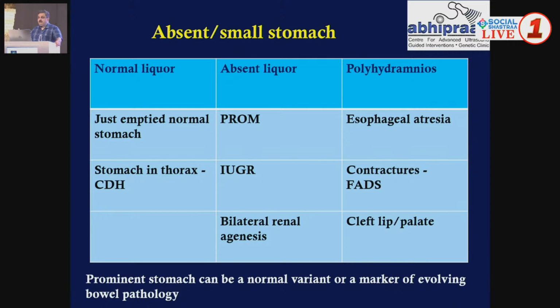So if you do not see the stomach, or if you're seeing a very small stomach, but you have a normal liquor, then it's probable that the stomach has just emptied. So make the patient wait for some time. When the fetus swallows, you can see the stomach filling. So what I generally do, if I need to confirm the status of the stomach, is I wait, or I actually follow the fetal swallowing. I go to the fetal mouth, see the swallowing movement, and try and follow it to see whether the liquor goes into the stomach.